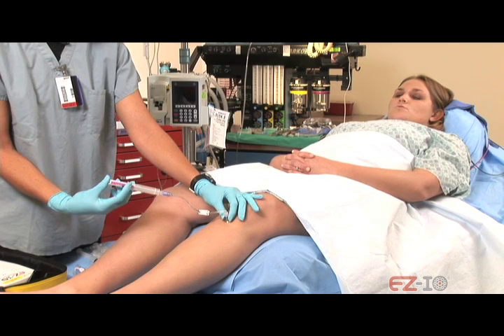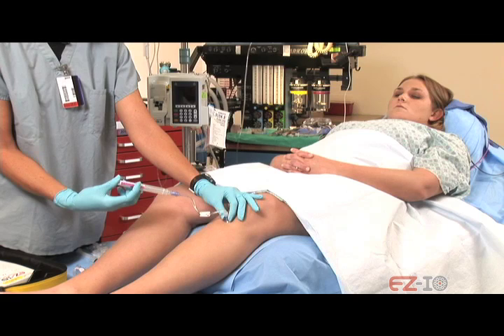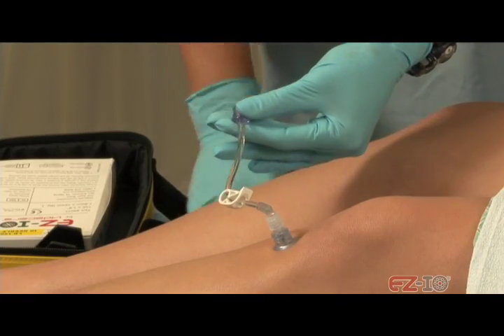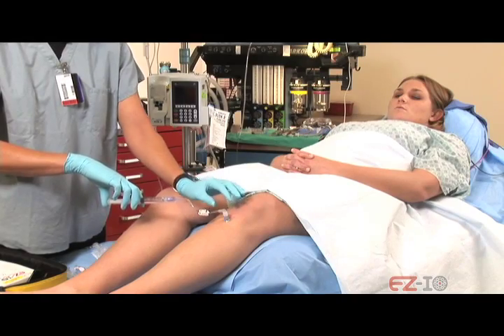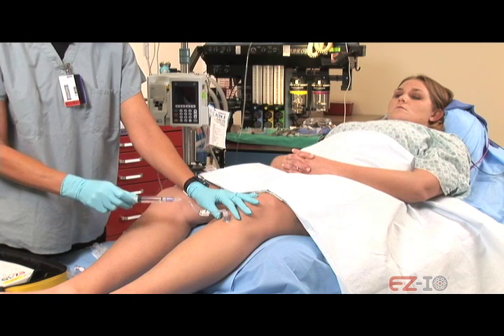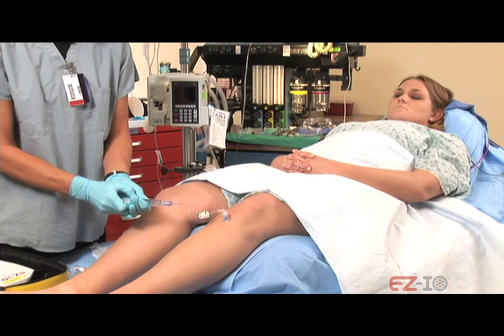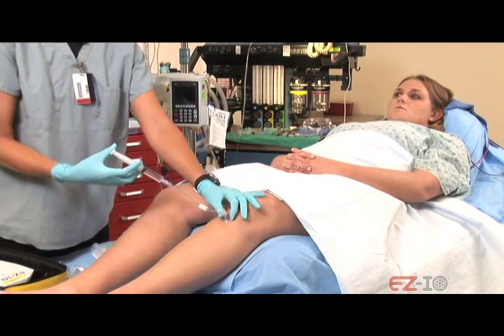And now? Maybe like a 3. Okay. And now? 3. Okay. Still doing okay? Mm-hmm. What's your pain level now? It's going down. 2. Okay. Now again, we're just going to go slowly here. Doing okay? Mm-hmm. Still doing okay? What's your pain level on a scale of 1 to 10? Like a 4. Okay.